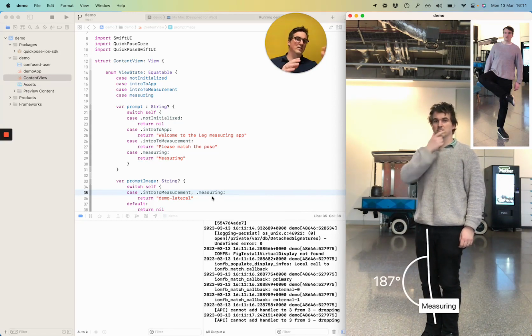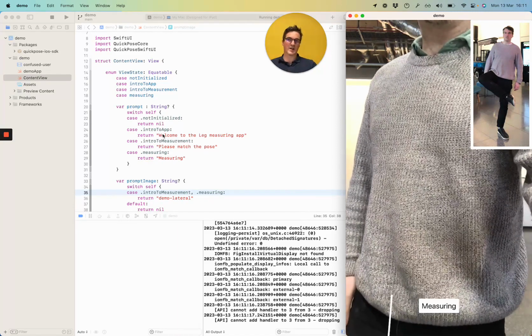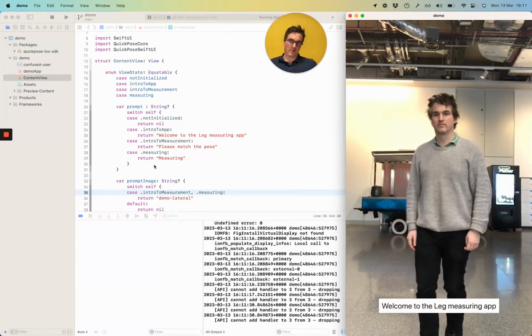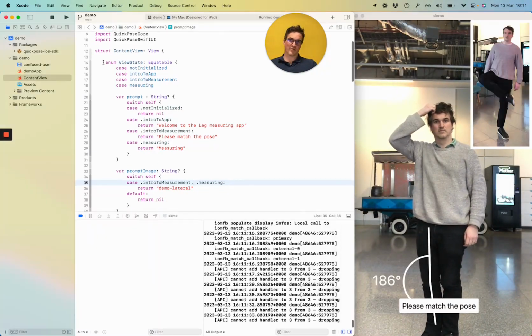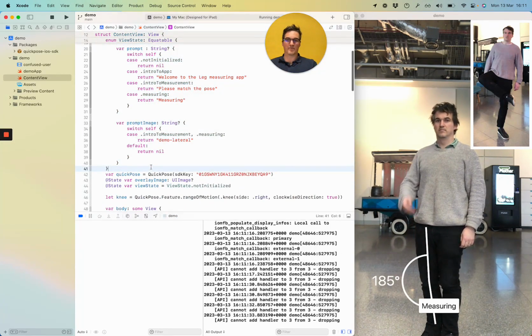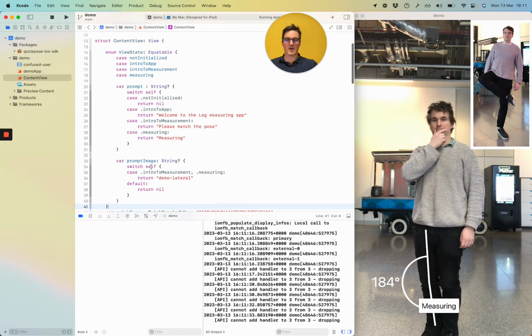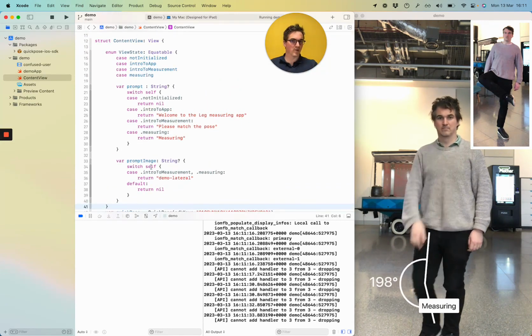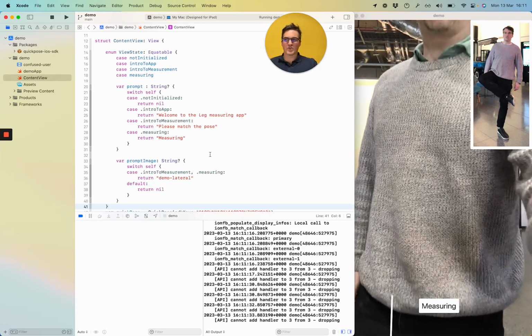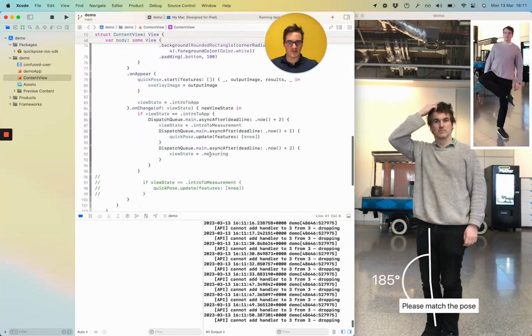If we had all these different features, like an image showing sometimes and a measuring bar showing sometimes, it would be really confusing without some form of structure like this. The next step for productionizing this will probably be to pull this logic out to a model, but SwiftUI has certain restrictions on models, and I want to keep this all in one view for now.